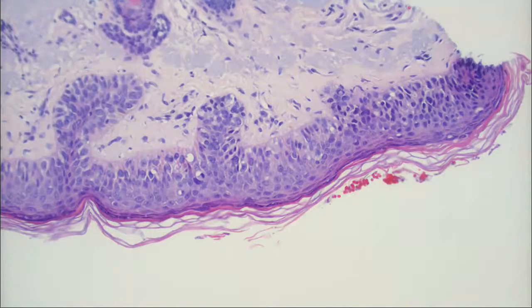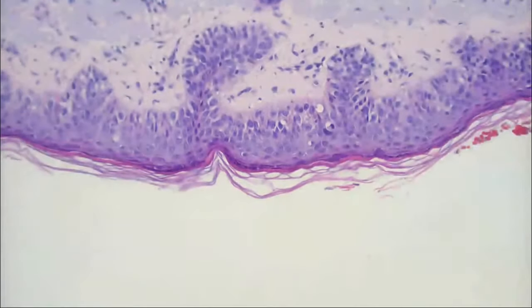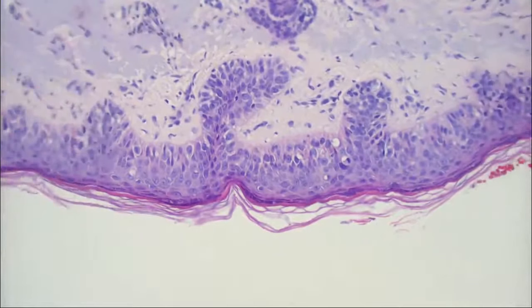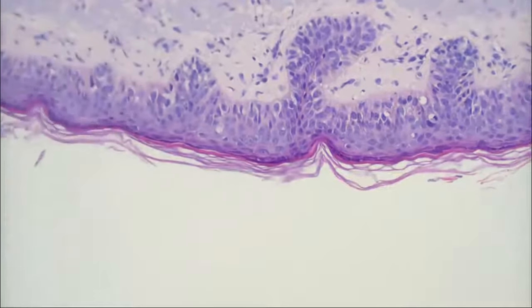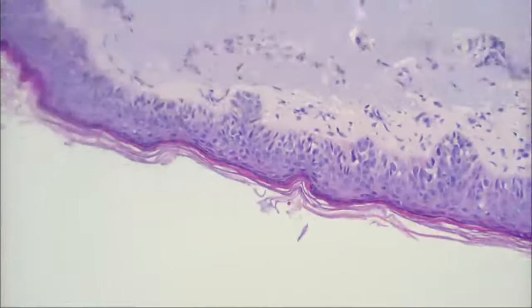The keratinocytes are just atypical. So you thought it was epithelial? Epithelial, correct. You thought it was probably squamous epithelial, since it's keratinocytic. Okay, good. So what was your diagnosis? The actinic Bowenoid disease. So you thought it was Bowen's disease, squamous cell carcinoma in situ? Correct. Okay, good.